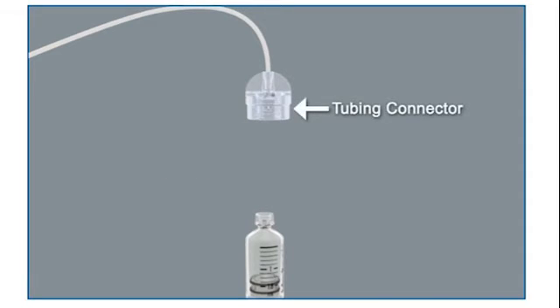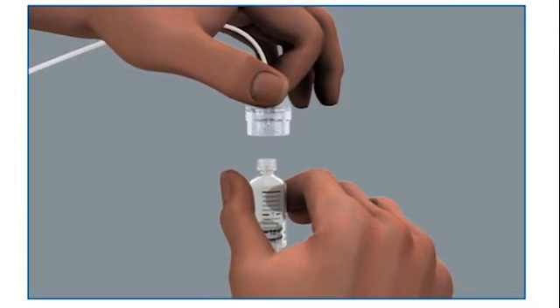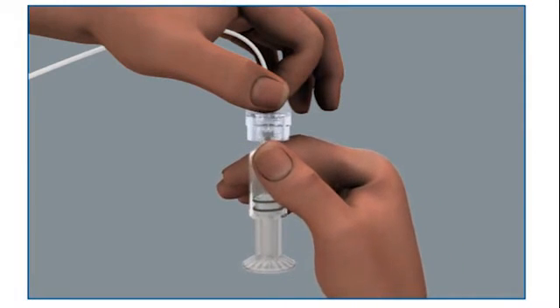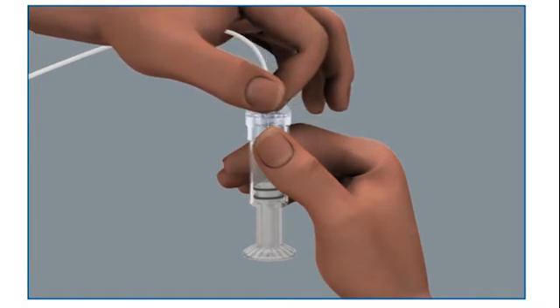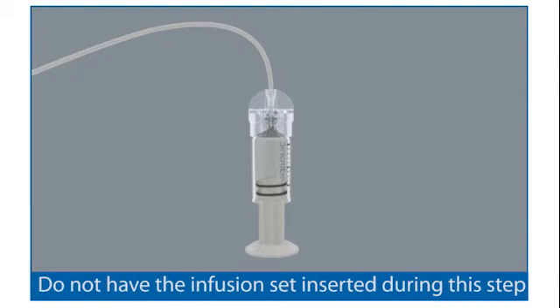To connect the infusion set to the reservoir, hold the tubing by the connector and place it on top of the reservoir. Find the right position by turning and gently pushing the connector until you feel it slide smoothly in place. Turn the tubing connector clockwise until the reservoir and the connector lock with a click. You should not have the infusion set inserted into the body when doing this step.